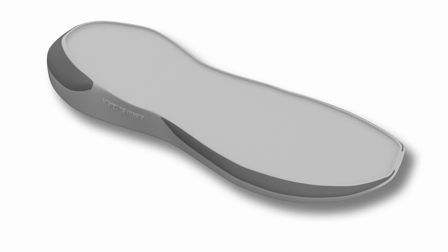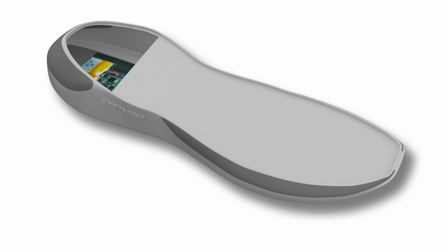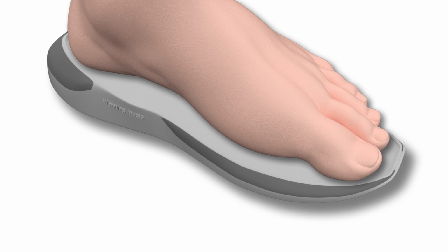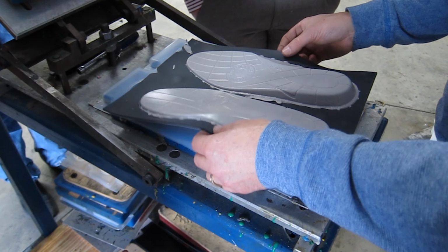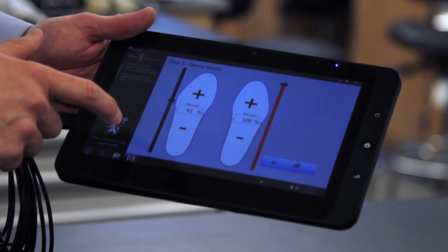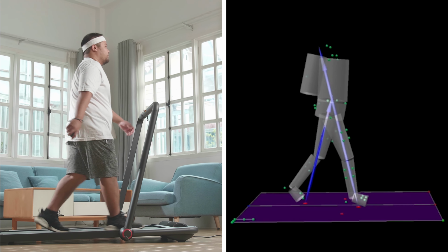One group of researchers has developed ways to improve balance and gait by applying imperceptible mechanical vibrations to the patient's skin, using vibrating shoe insoles. Elderly patients who wear these insoles regain the ability to move as they did when they were many years younger. The insoles also help improve balance in people with stroke or diabetes-related nerve damage.